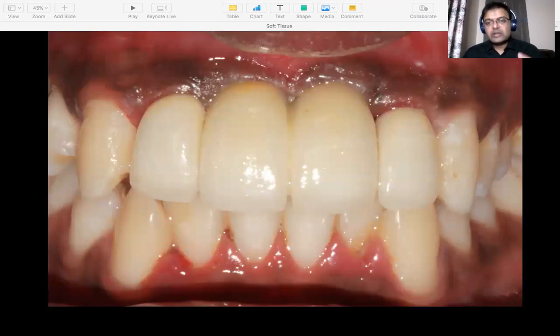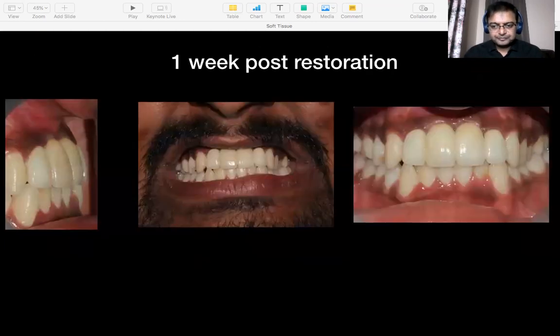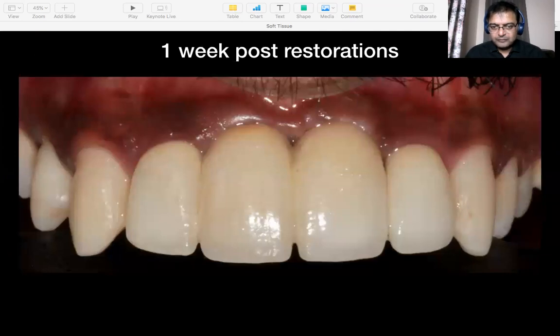And what this does now, you see a good bulk, so that facilitates hygiene. You have a good amount of keratinized tissue that facilitates brushing, and a papilla that looks nice and neat. So that's what we have now in this patient, 1 week post restoration.